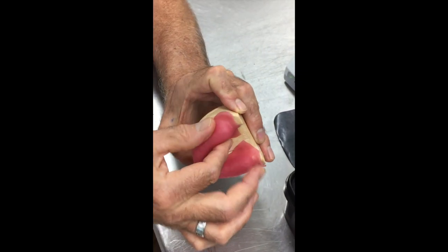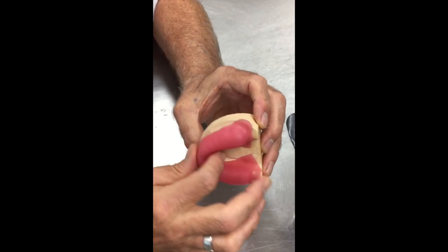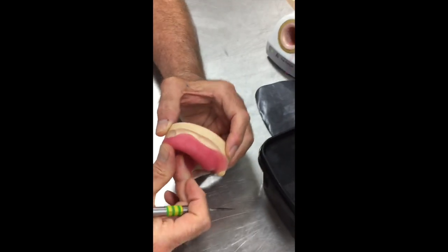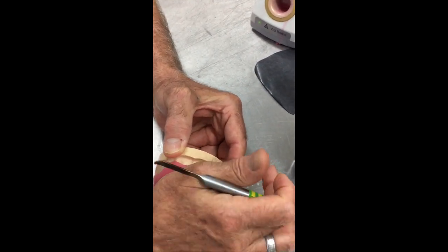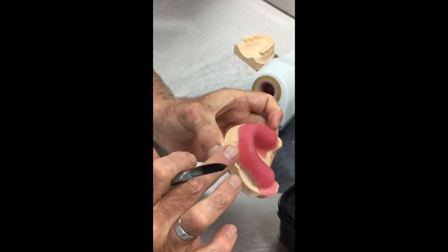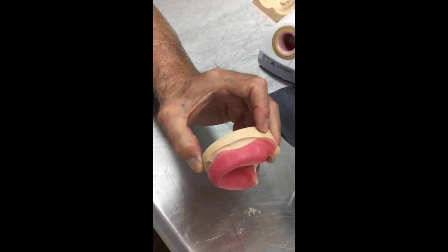procedures of taking the impression, or if someone's going through the sterilizing process with it and so on, when they might bump it. We want it to be effective and solid. So if we have an area like that where we're a little bit short of that periphery, I'm just going to press it up here and then work it down over a long area, and we don't get any thin spots, but it comes down to that periphery and it remains quite thick at that periphery. We don't push it into a thin area.